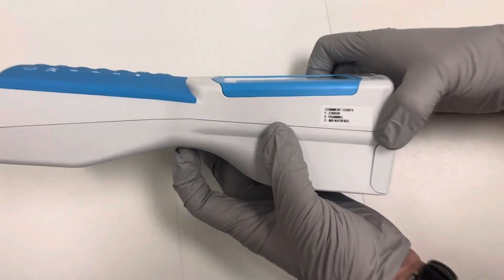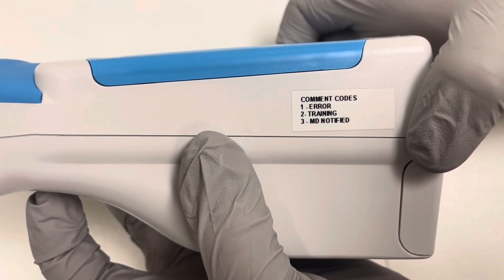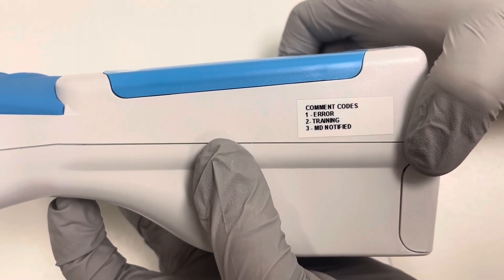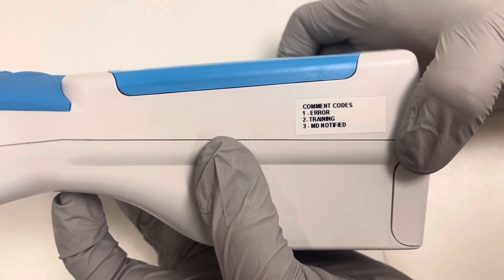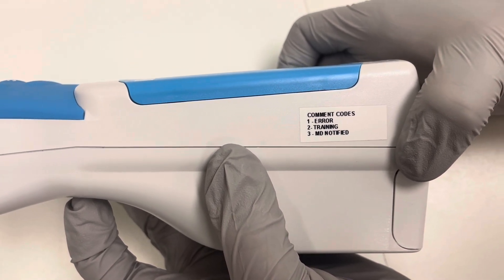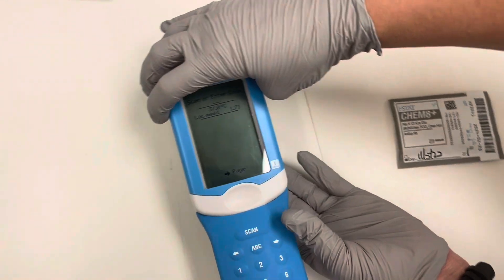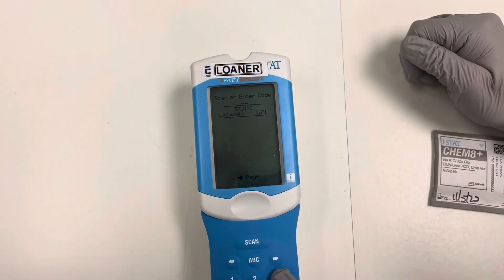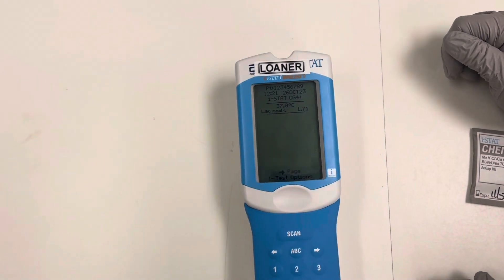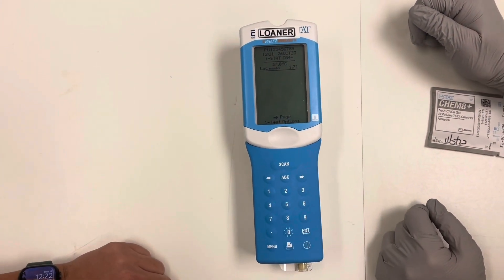On the side of every iStat, we put what the comment codes are. One is error, two is training, three is MD notified. Codes one and two — if we don't want the results to go in the patient's chart, you would select one or two. Three is just that you notified the MD. We will select three and then enter. You can see our lactic of 1.71 here.